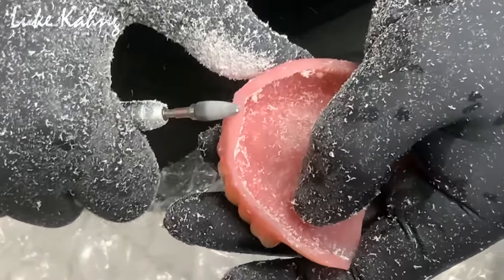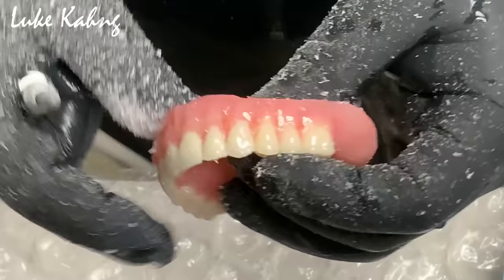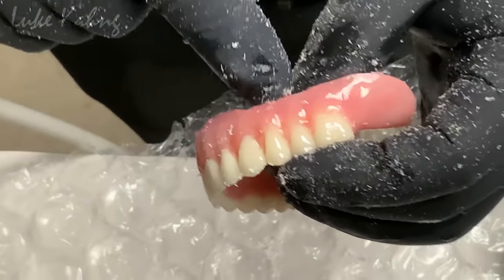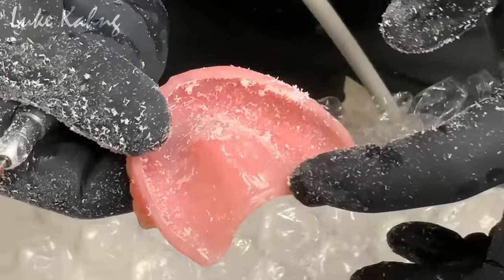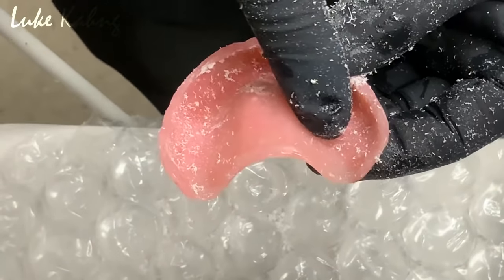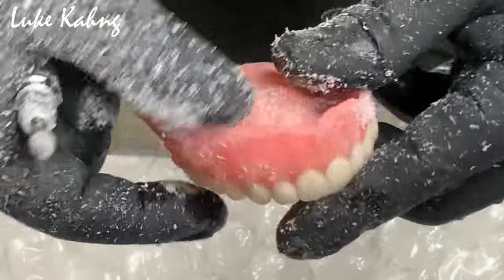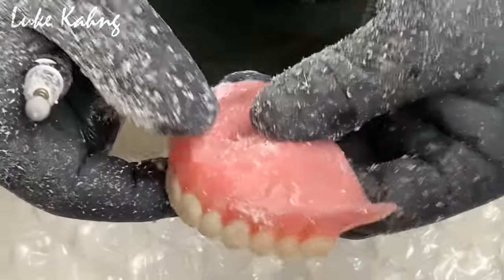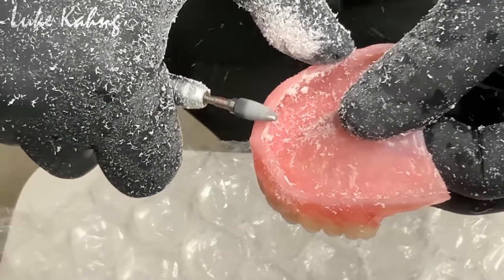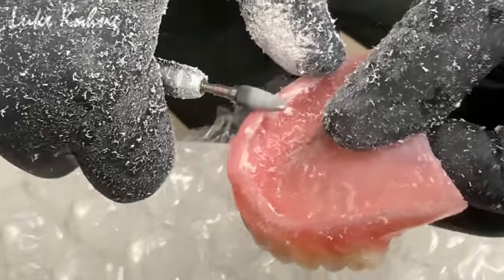Right now, the front is just a little bit too much on him. We make sure not to mess around with the distal borders back here. The posterior palatal seal, you don't want to mess with that. You don't want to mess with that right in here. So I know when it's a little high up here from going in and inspecting the sulcus.